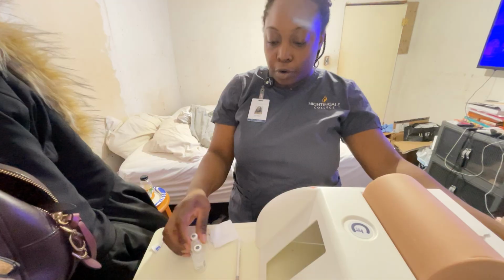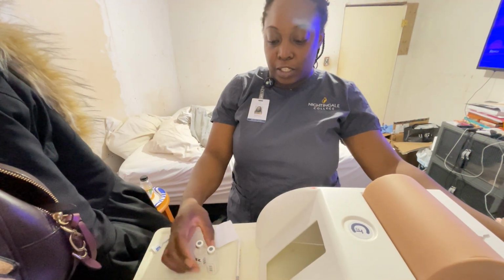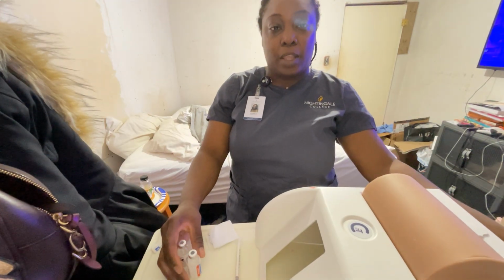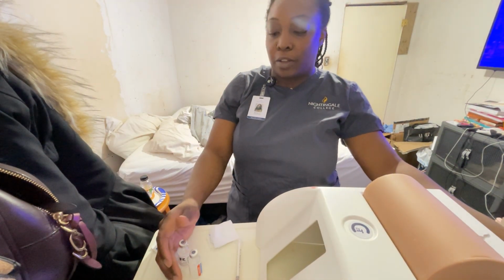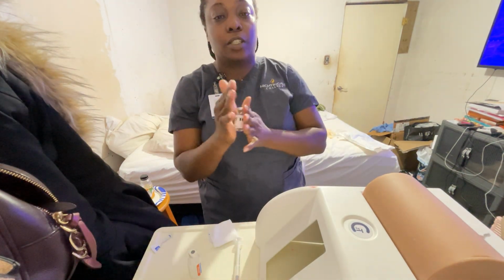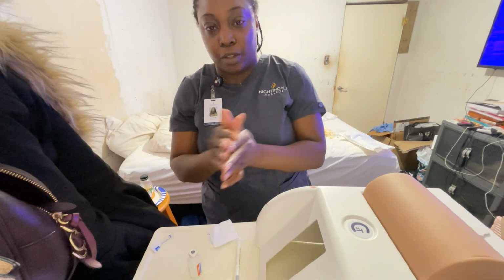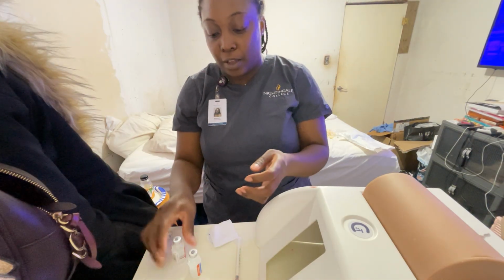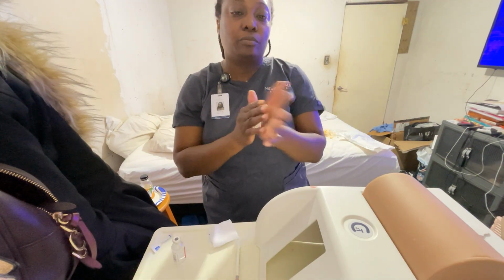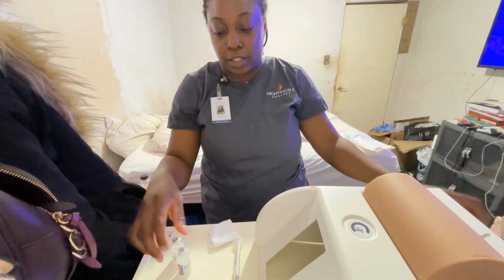So the first thing I would do is give these two medications a mix because they've been sitting around for a while in the medication Pyxis or what have you. So then I would just give a couple of shakes in between my hands to warm it up and get things reconstituted, or remixed how it should be. Alright, so my medication is mixed.